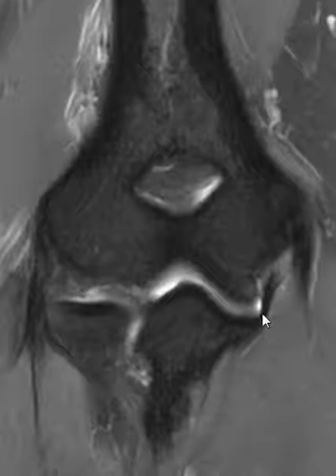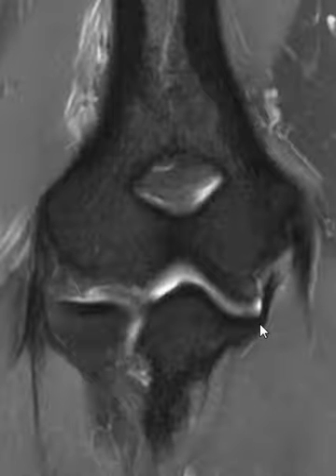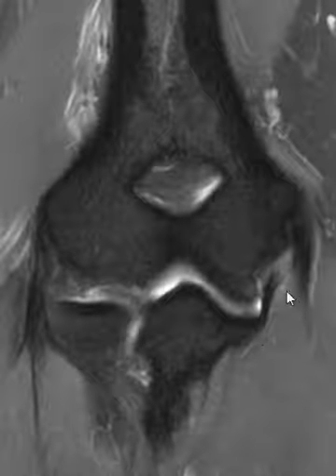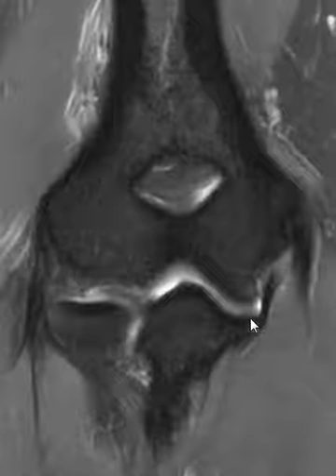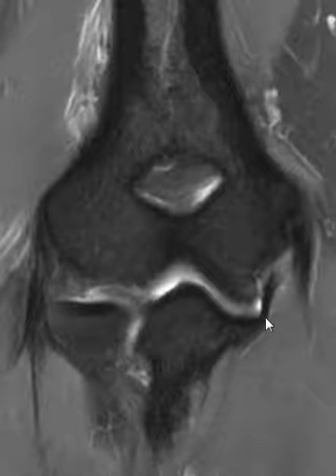That last patient had a tear right at the UCL attachment to the sublime tubercle. There's a little vertical band, but this is a normal attachment of the distal medial ulnar collateral ligament. Here it comes down, nice and dark and black, and right at the attachment there's no cleft of fluid going in there — nice and beautiful.